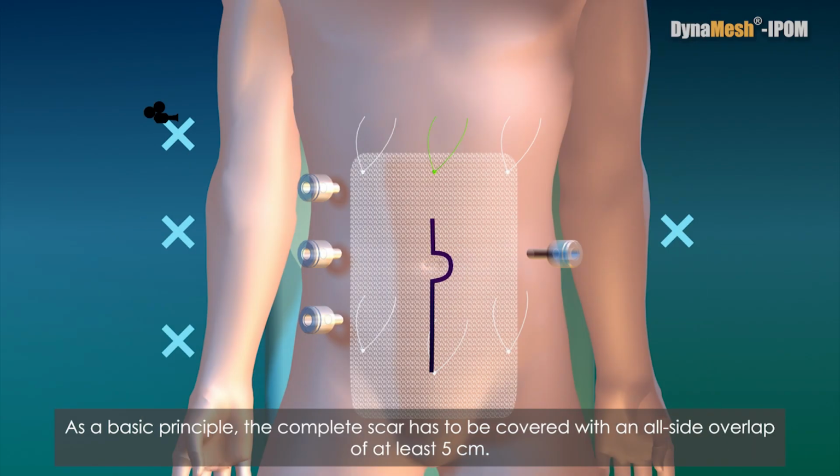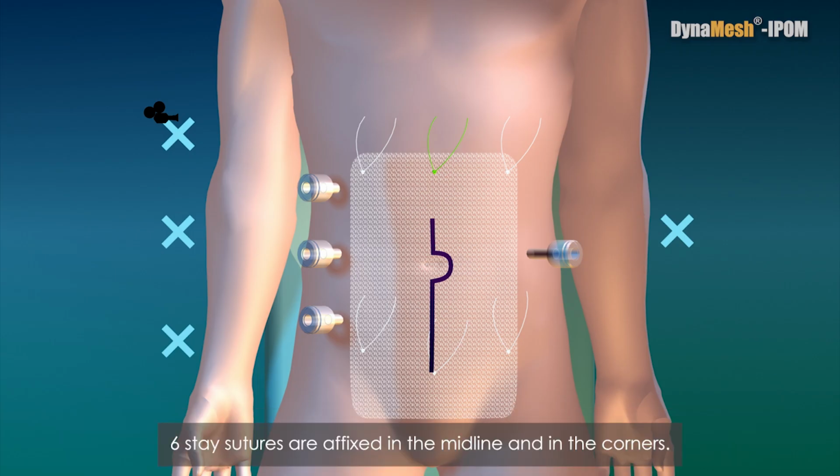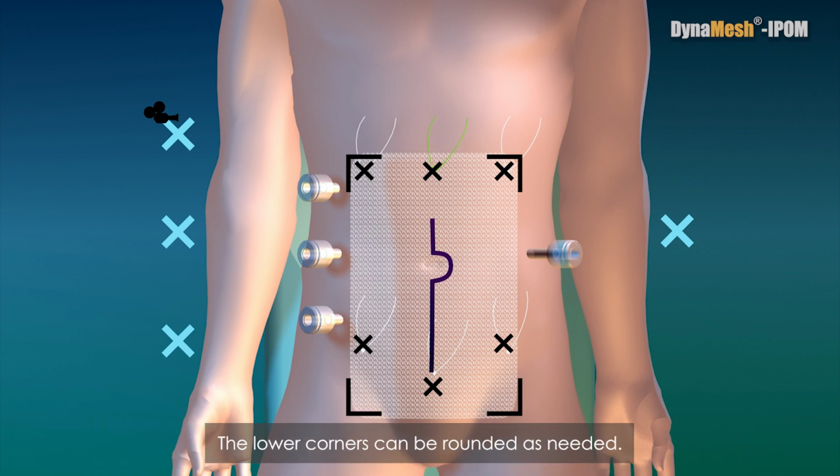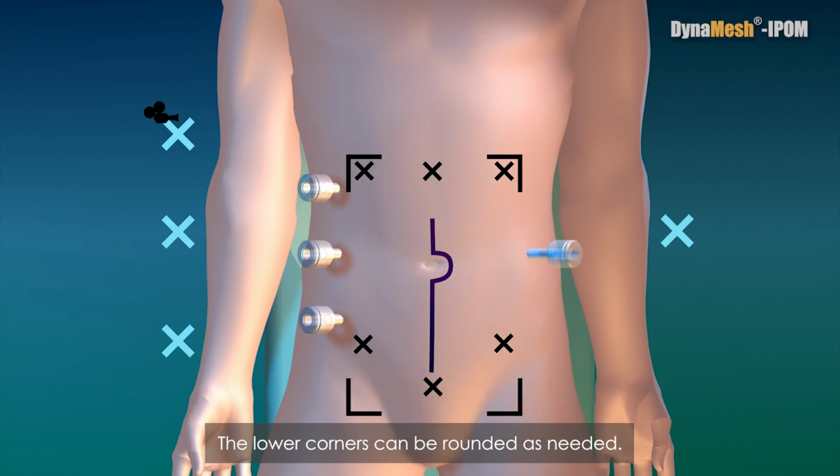As a basic principle, the complete scar has to be covered with an all-side overlap of at least 5 centimeters. 6 stay sutures are fixed in the midline and in the corners. The caudal stay suture is attached 4 to 5 centimeters away from the lower edge of the mesh in order to allow an overlap into the prevesical space. The lower corners can be rounded as needed.